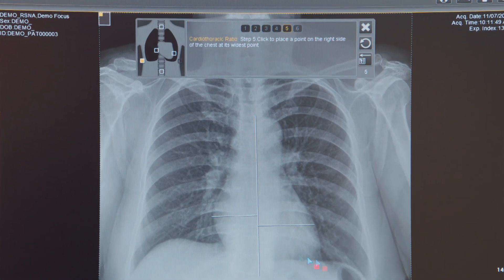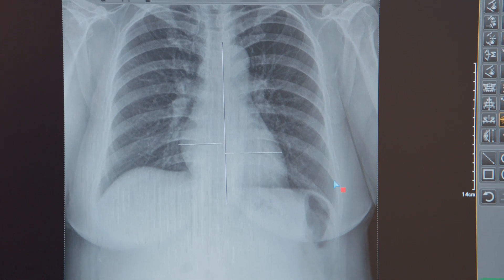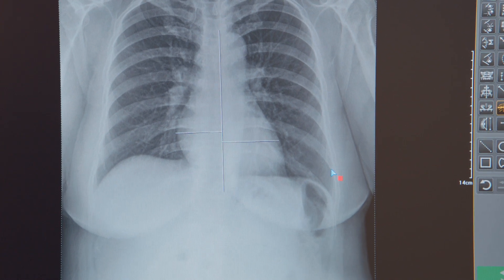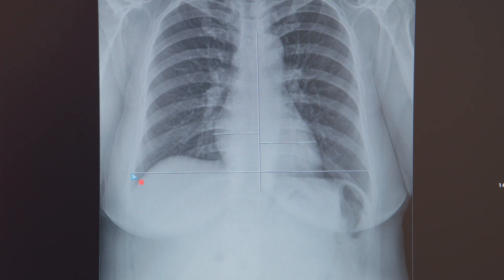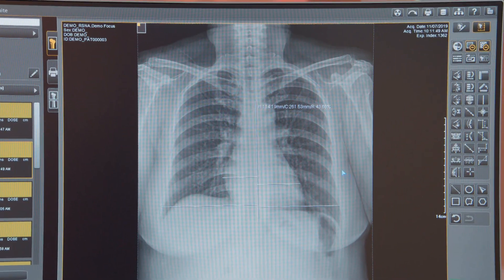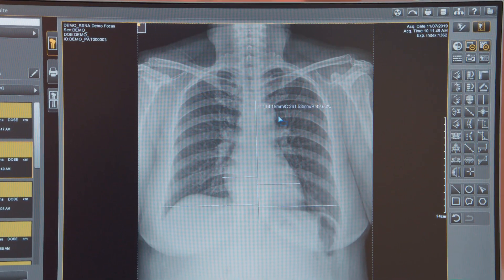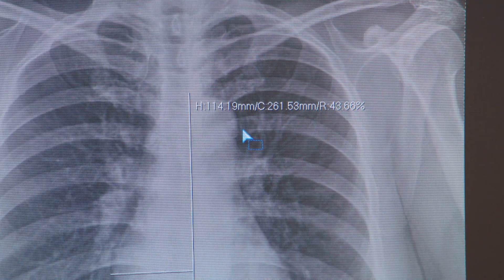To complete the measurement you're going to select the widest part of the thorax on the right and again on the left. Once complete, the ratio is displayed directly on the image. As you can see, the on-screen guides make it simple to do advanced measurements in ImageSuite.